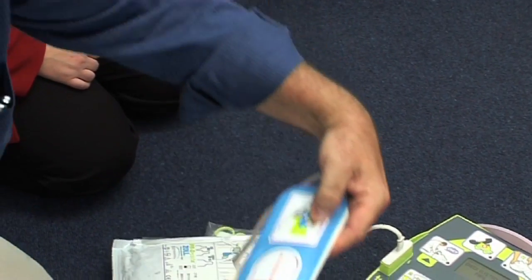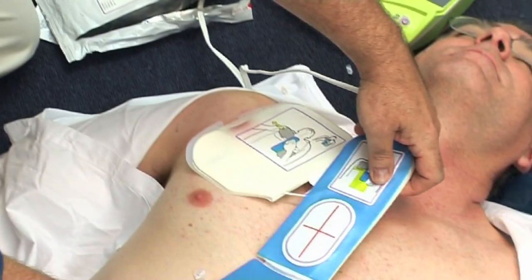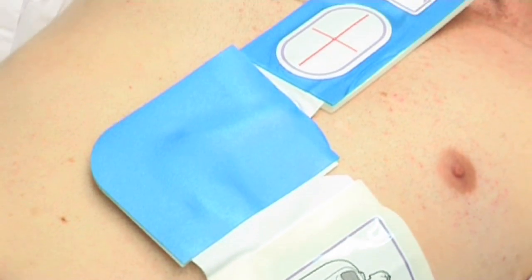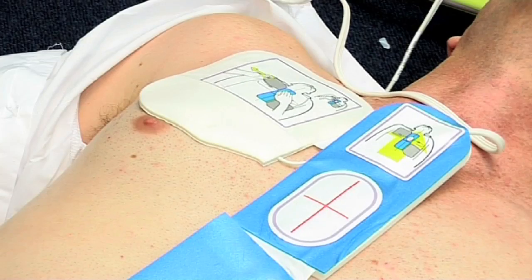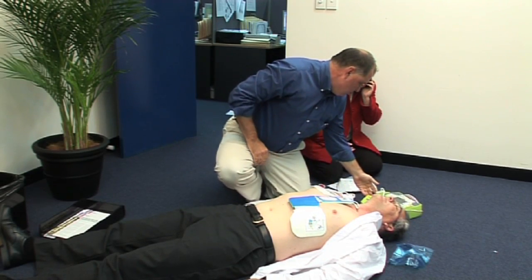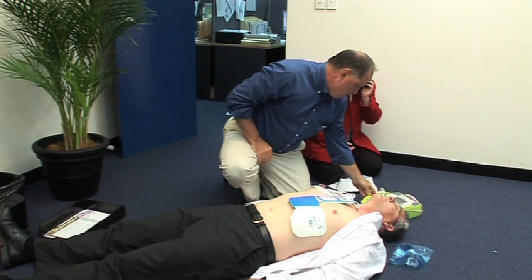Unfold the electrode pads as per the diagram. The CPR sensor needs to be on the middle of the patient's breast bone, about a hand span down from the neck. If the patient has a pacemaker inserted, then place the electrode pads approximately 10 cm away.